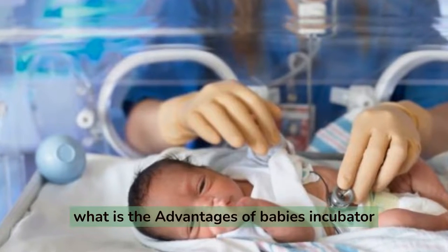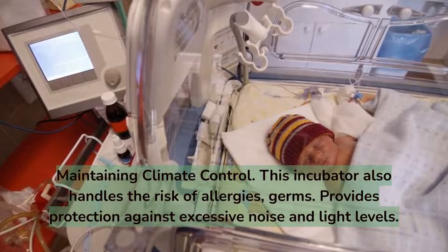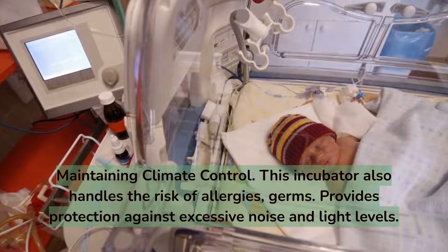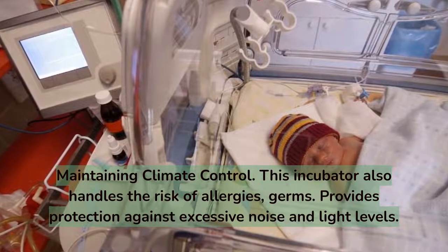What are the advantages of a baby's incubator? Maintaining climate control is a key benefit. The incubator also handles the risk of allergies and germs, and provides protection against excessive noise and light levels.